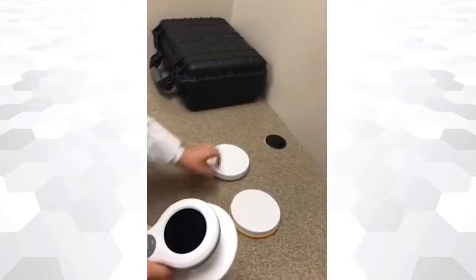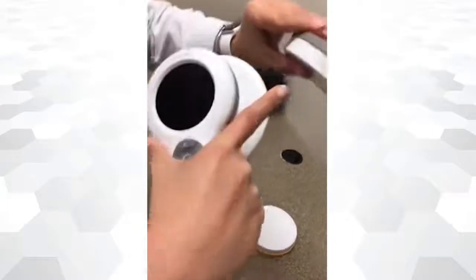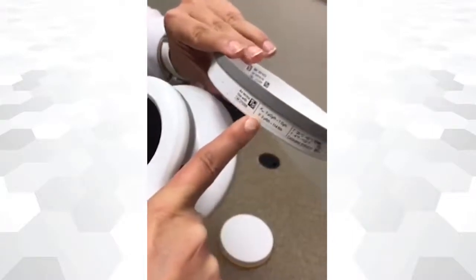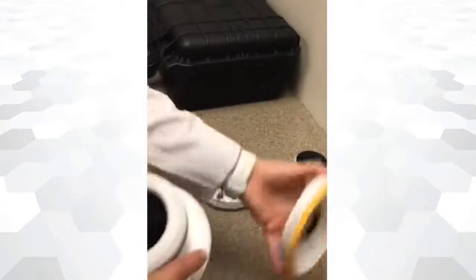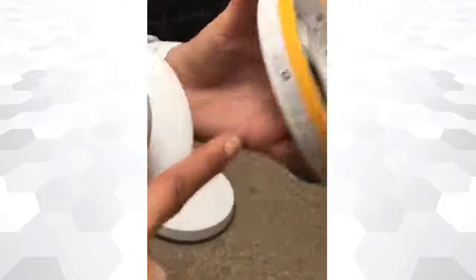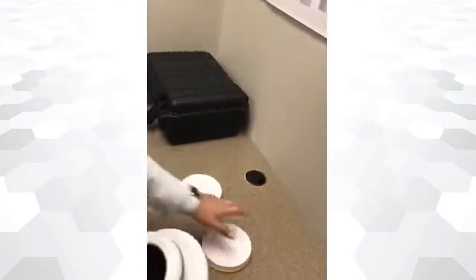There are two lids. The gray lid identifies the measure for air kerma, and its label contains additional information regarding the ranges to perform air kerma measurements. The yellow lid identifies the measure for ambient dose equivalent, and its label also contains additional information regarding the ranges to perform ambient dose measurements.